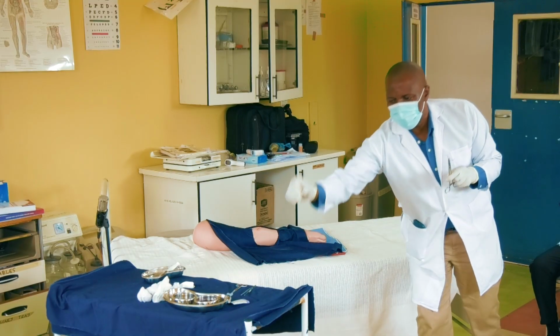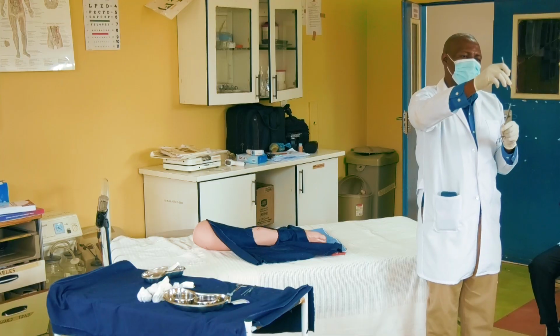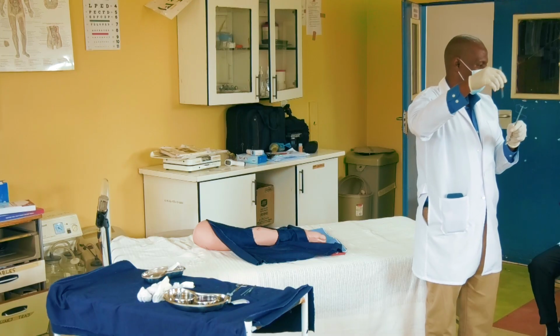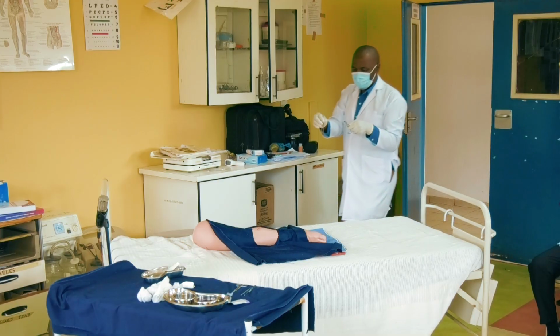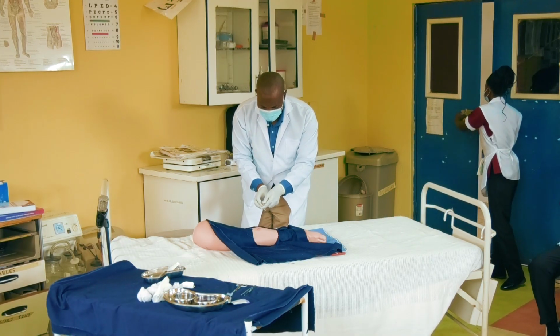Tooth dissecting forceps. This is a forceps that we use. It has teeth, right? We also have non-toothed, which is flat. Tooth dissecting forceps is used for tough tissues. The skin is tough, right? So non-toothed, you use it for soft tissues, like the ones that are inside of the body. Some of the tissues. Okay.